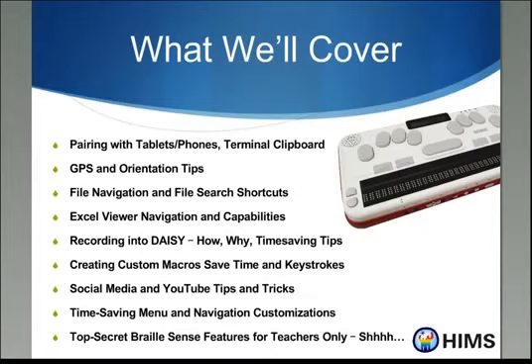We'll talk about social media for a little bit because we can't avoid it. That's what our students are doing. They're all out there on Facebook and Twitter and playing with YouTube, so we may as well join right in. Then we'll also show you how, if you want, you can lock out the aforementioned social media applications on the BrailleSense. If you send us an email, and as long as we're sure that you're not a student, we'll send you a top secret document on how you can password protect it so that your students can't just go and unlock all the social applications and other things you just locked them out of. So you've got some limited parental controls that you can use. And with that, we will get underway.